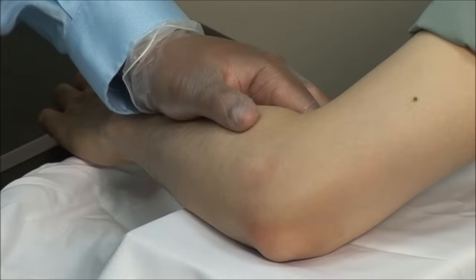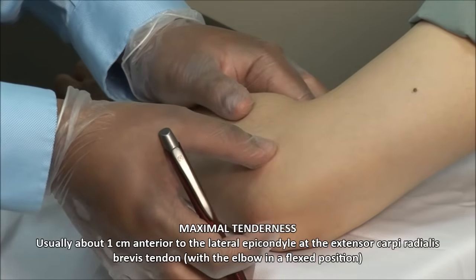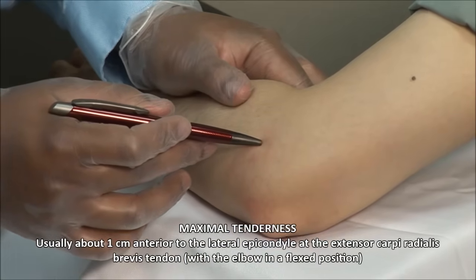Steroid injections are quite helpful, but are generally not the long-term solution. Identify the point of maximal tenderness. This is usually slightly anterior to the lateral epicondyle over the common extensor tendon, particularly that part formed by the extensor carpi radialis brevis muscle.